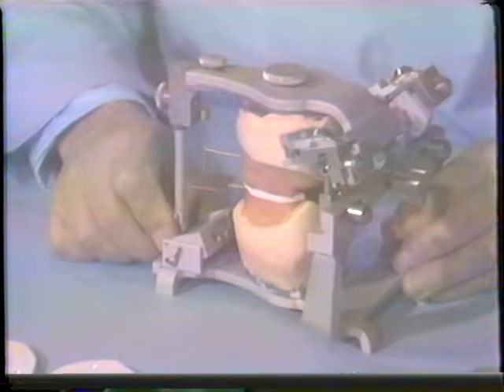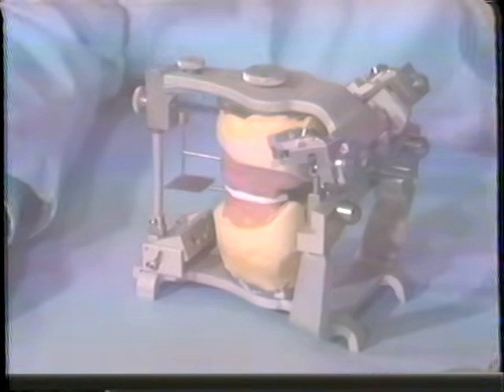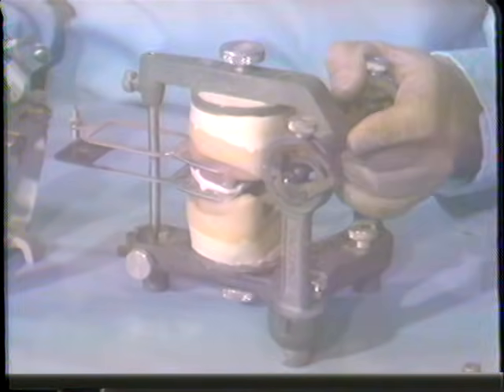Now another thing I'd like to point out at this time, because it's the first time that we've come into this particular design, in addition to the classification of instruments that were reviewed a bit earlier, instruments are also known as arcon and non-arcon instruments.